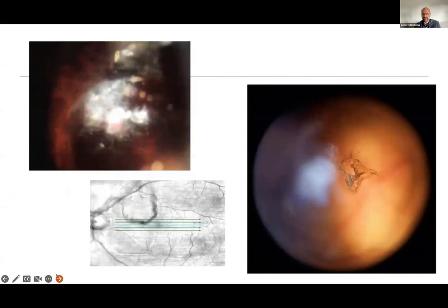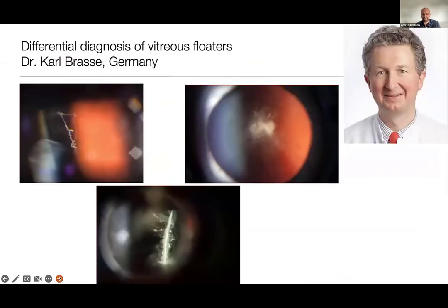When it comes to fundus photography, obviously traditional eye fundus photography makes sense, but I guess that the presentation of Dr. Karl Brasse will explain to us how important it is, based on the picture and the ophthalmoscopic approach, to assess the type of the floater, and based on the type, try to focus on the potential outcomes of treatment.